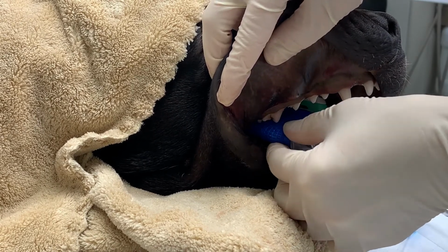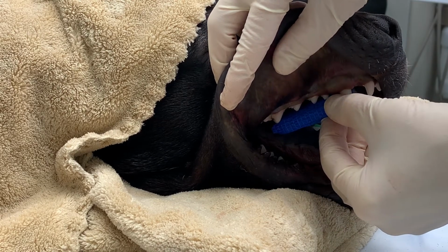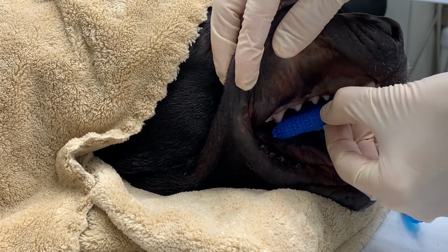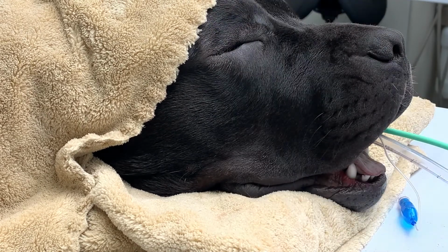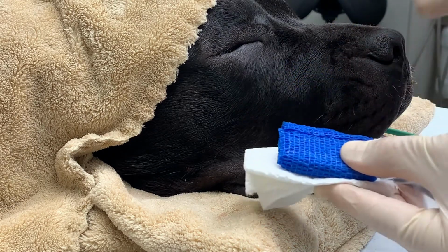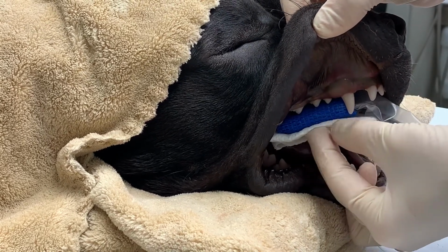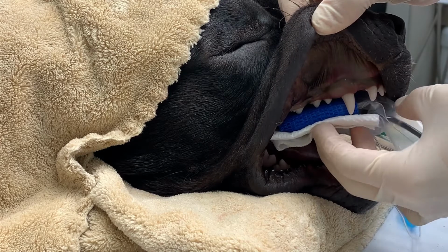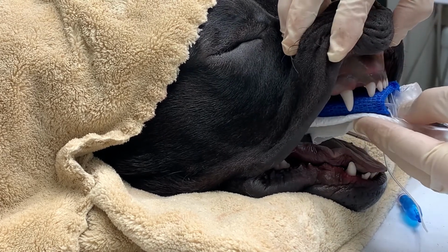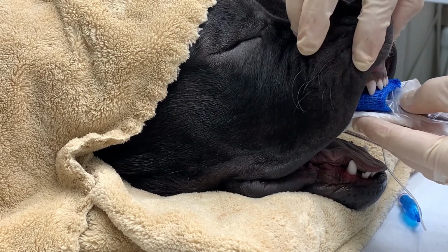Now, when we start moving forward to these first, second, and third premolars, we are going to need something to help us keep that sensor parallel to the palate. So what I like to use is a paper towel or gauze, and I place that underneath the sensor, and now I can position that right underneath that first, second, and third premolar. And then I can continue to move this sensor forward and acquire all of the images here on the patient's right side, along with all of the incisors.